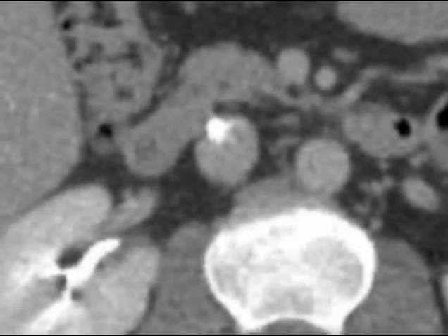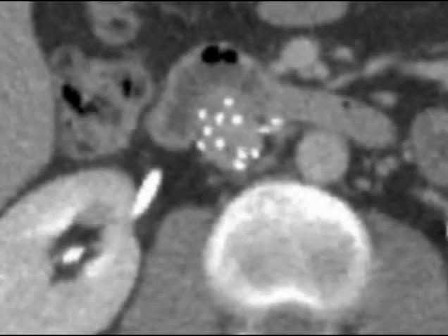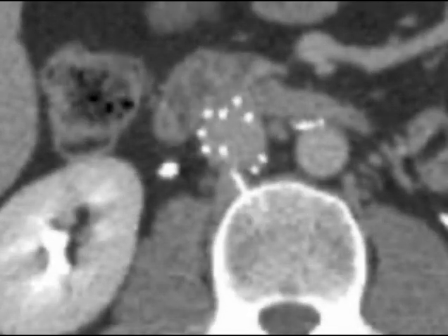The jaws of life technique for complex filter retrieval begins with a CT scan during the initial office visit to look for clot in the filter, penetration of filter components, and any fracture of filter components.